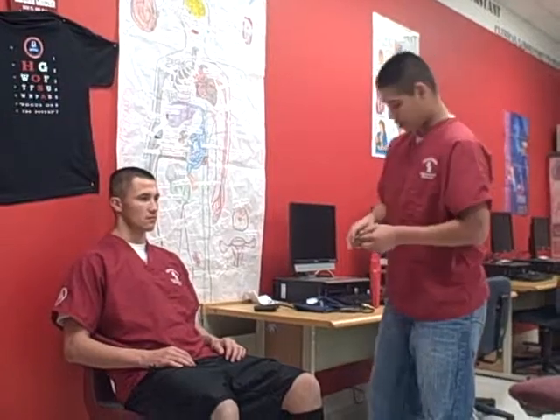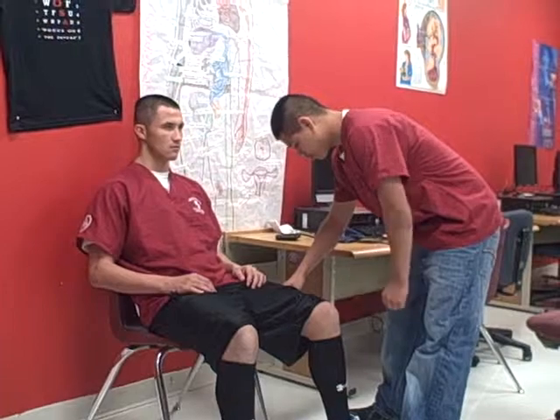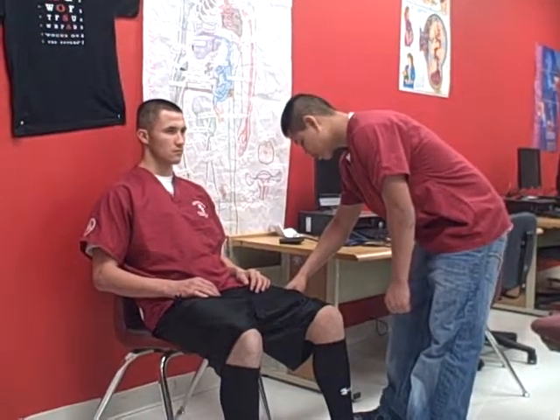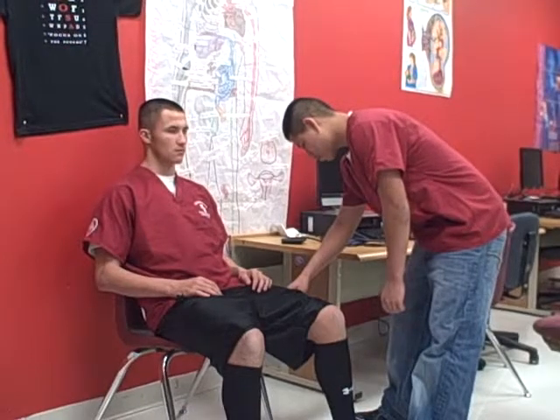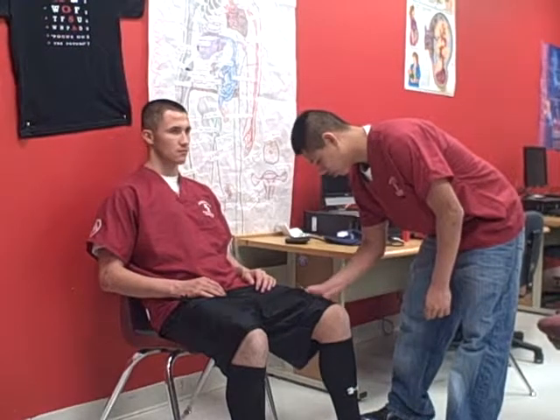Now I'll remove the safety cap and inject it and hold it for 10 seconds. Now we'll remove it and apply pressure to the injection spot and rub it.